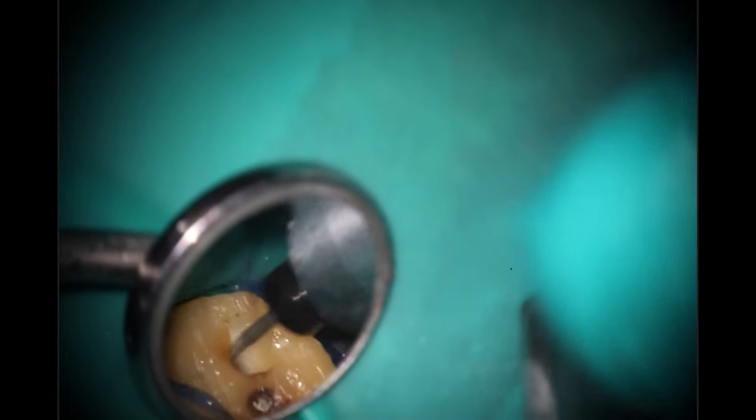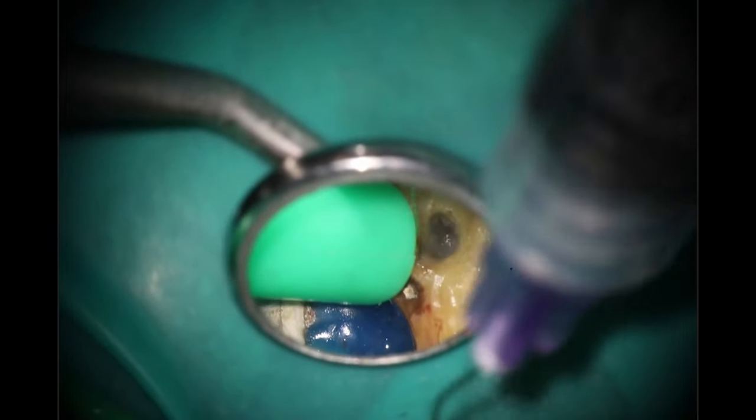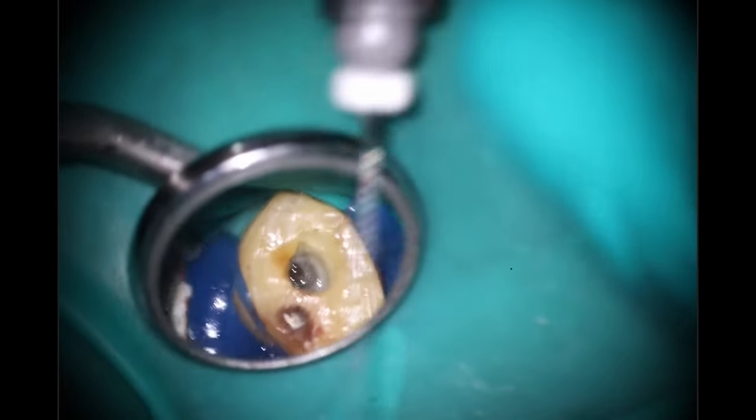I still remember when he was talking to the endo study club way back in 2010, talking about how he doesn't even use the stoppers. After working for so long, I can now tell the difference between an 18 and a 19 very easily just by looking at it. So rinsing it out here and I'm still having issues. First thing I'm going to do is go back with that 8C file and see if, since I've cleaned out the top of it, I can create a little bit more of a pathway to get down there. Going back in with the 8C on that MB — we're still hitting a wall.